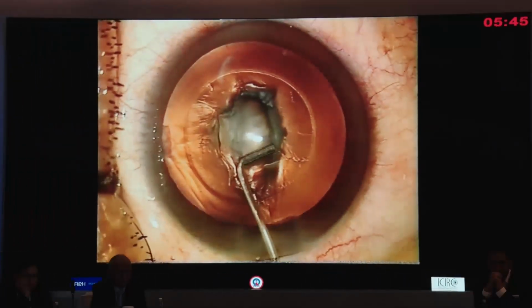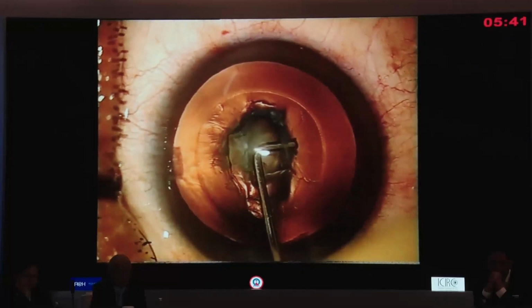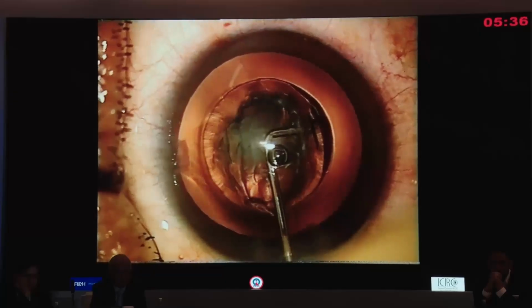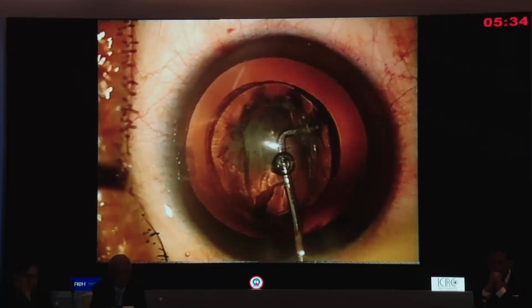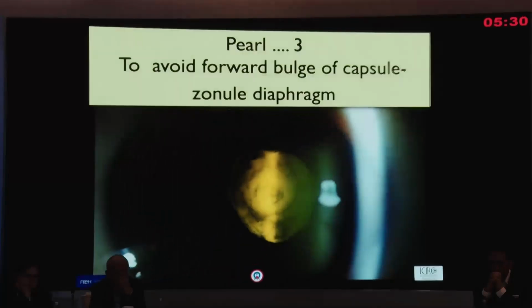As this video illustrates, you can have a thin epinucleus or a thick one, depending upon the depth that you penetrate. In a typical classical posterior polar, it's not difficult, and with one injection you can create it, but sometimes you have to go to the other side and so on.